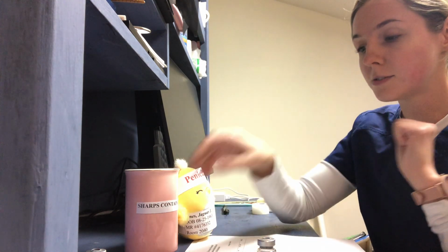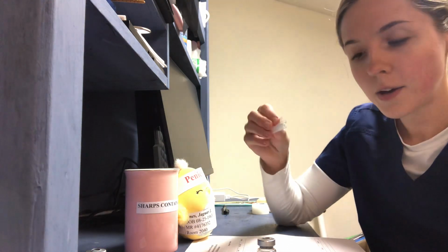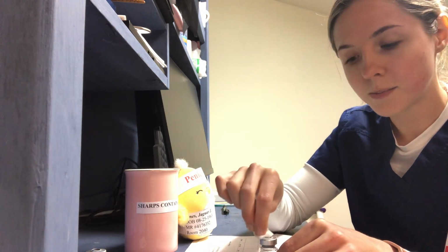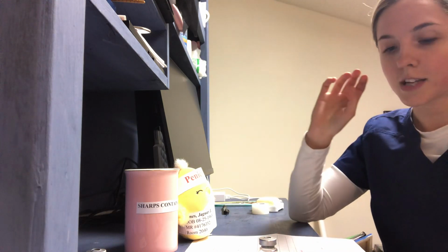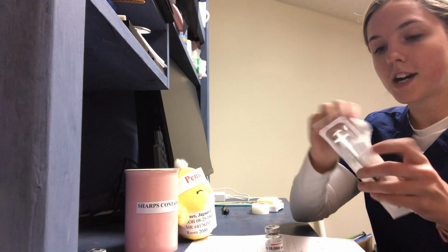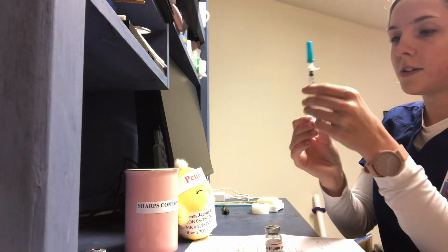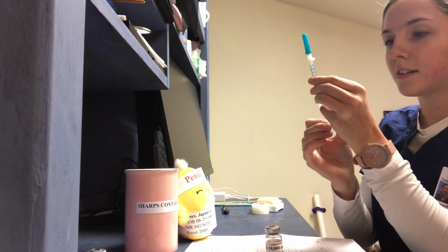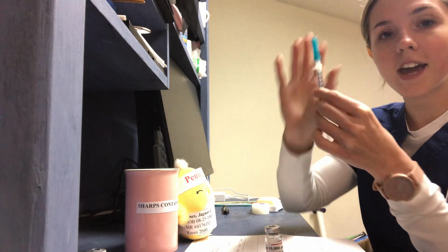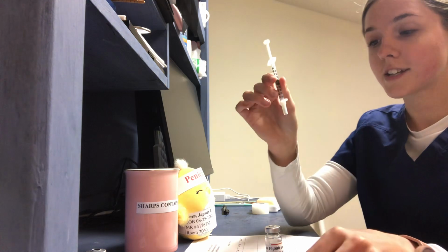So I'm going to first start out by cleaning my medication vial. I'm going to start in the center, do circular motion outwards, not going over the same place twice. And then while that's drying, I'm going to take out my tuberculin syringe, draw up half a milliliter of air. Alright, so now that I have half a milliliter of air, I'm going to inject this half a milliliter of air into this clean vial.